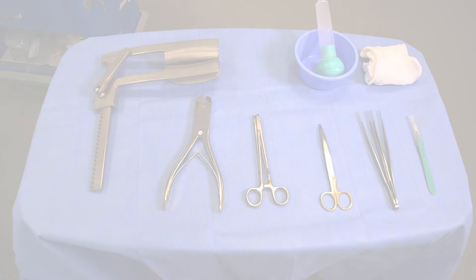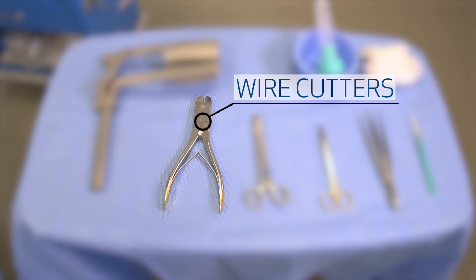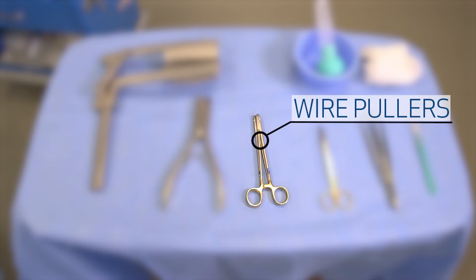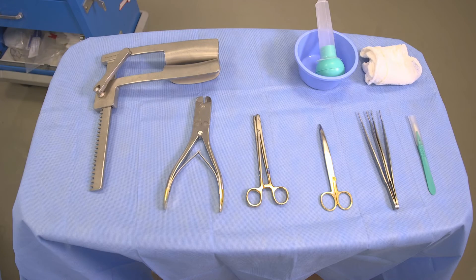The patient is now ready for open sternotomy. Remember, the patient must be adequately sedated and paralyzed for this procedure. The open chest kit, retractor, wire cutters, scalpel, wire pullers, and scissors should be ready on a separate prepared sterile field.